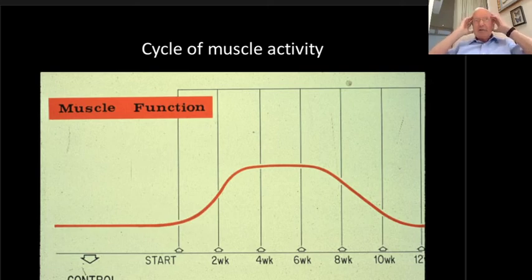vibration, the activity in the muscles, not simply around the mouth, but you will find that the masseter muscle gets tense, and the same applies to the temporalis, and all of these muscles are working harder when you advance the mandible. And it's that muscle power that corrects the malocclusion. We are using the forces of occlusion to correct the malocclusion.